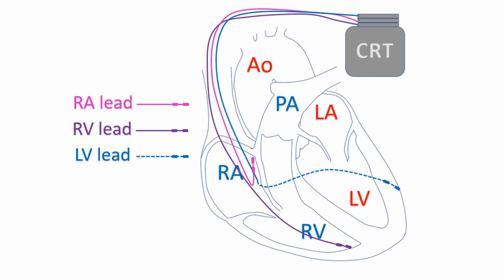Cardiac resynchronization therapy (CRT) is used when the contraction of the left ventricle has lost its synchrony. Left ventricle is the lower left chamber of the heart which pumps oxygenated blood to the whole body.